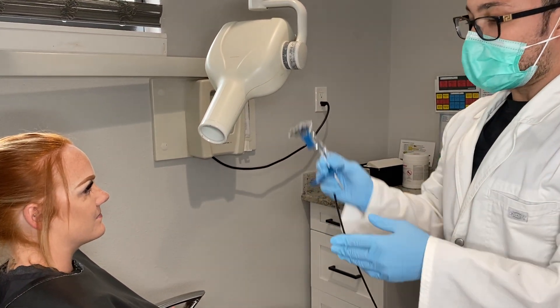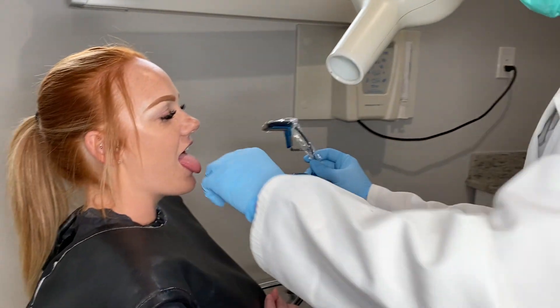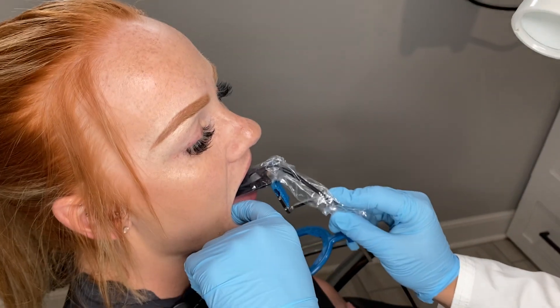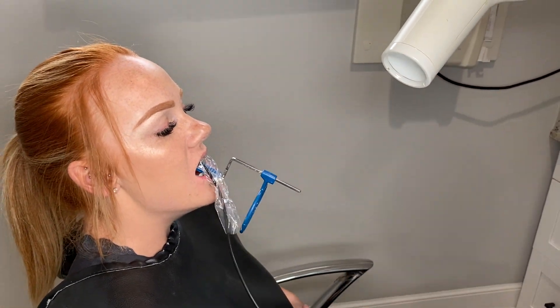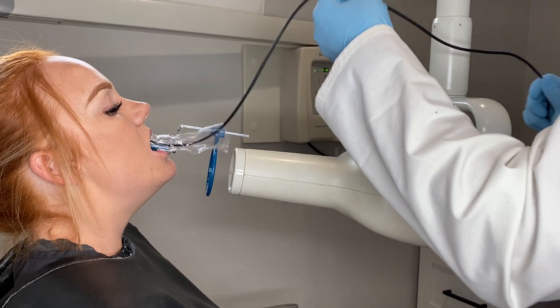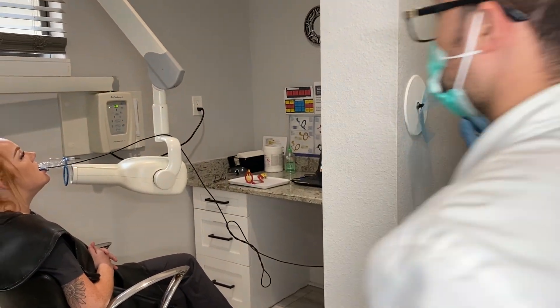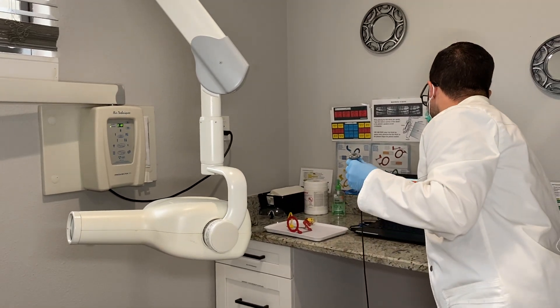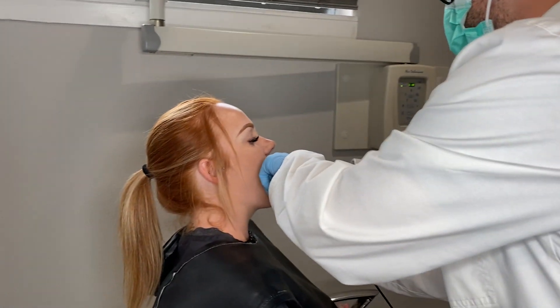For the lower anteriors, we're just going to flip this — same type of deal. You don't have to take the target off or the bite tab; you're literally just taking it from the upper and turning it for the lower. She stuck her tongue out — you can use this almost like a fulcrum. Go ahead and rest the sensor on her tongue and push back gently, then bite down. Remember the wire always has to be out of the image, so make sure you move it before shooting.